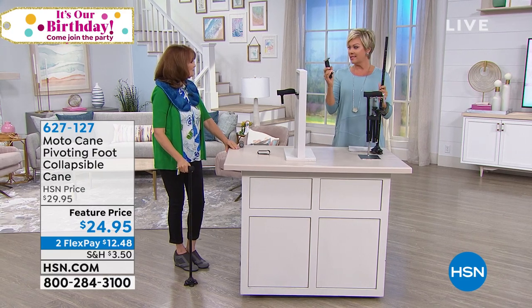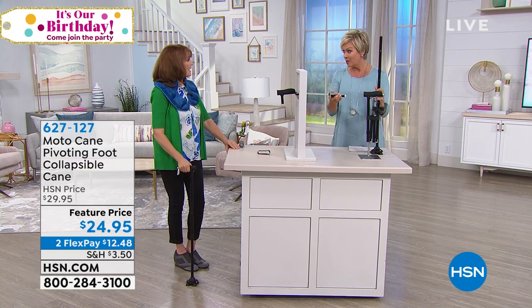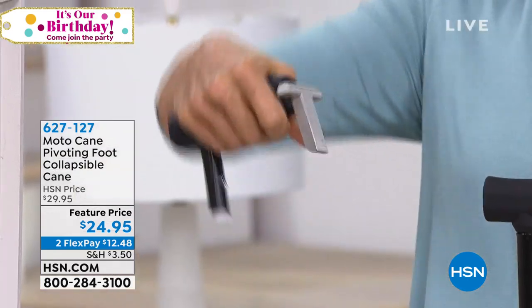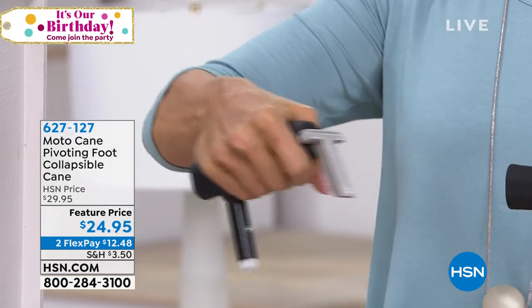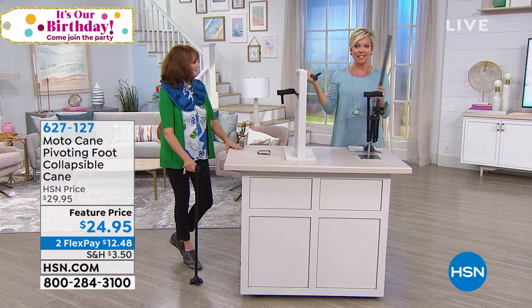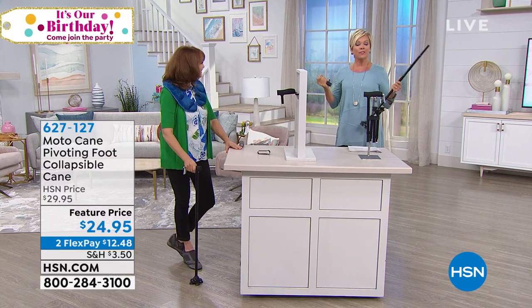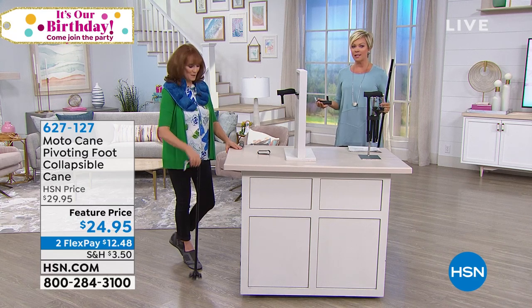I particularly love that it opens up so easily on its own — you don't have to figure out what goes where; it automatically assembles itself. These car assists are sold separately, probably at about this price, just for one handheld device to help yourself or a loved one get out of the car. This is attached to the cane, so it does double purpose — dual whammy — for a safer, more stable walking experience.